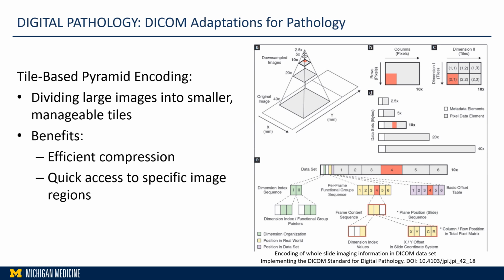So imagine in this picture I'm showing you, this is a strip and all these pixels are stored on this strip, and also all the pixel metadata. I'm talking about pixel metadata like what is the magnification, what is the compression ratio, what is the ICC color profile. Every single bit of the pixel is already stored in this DICOM format.